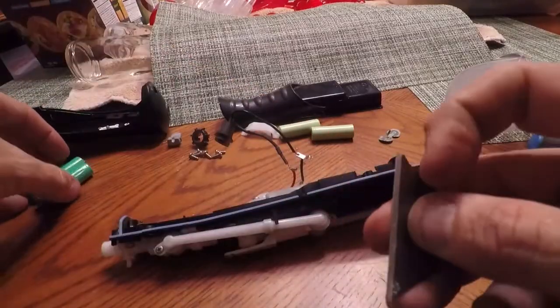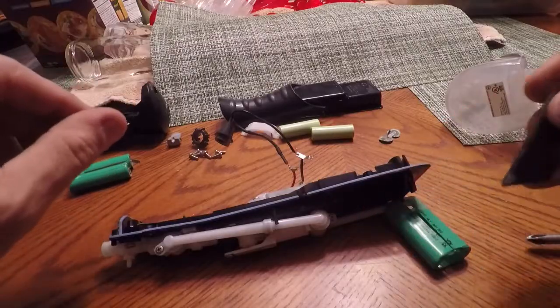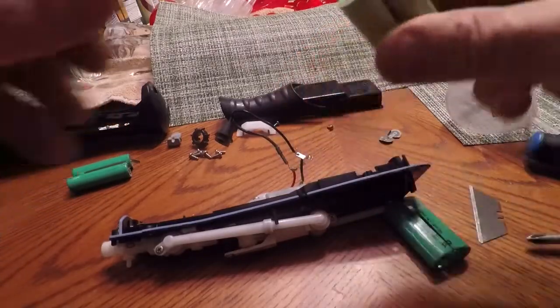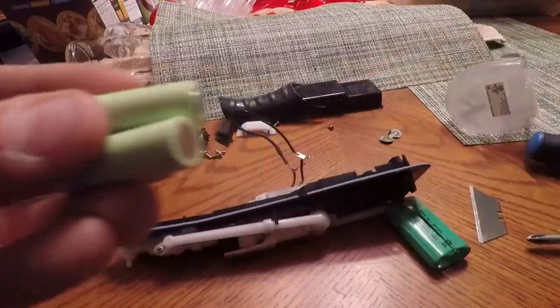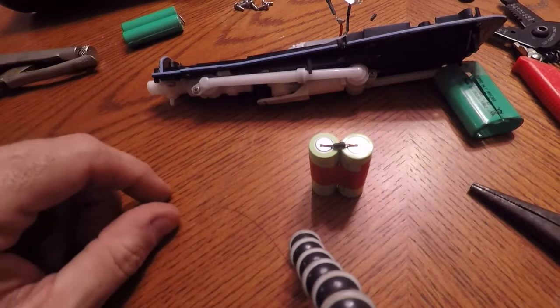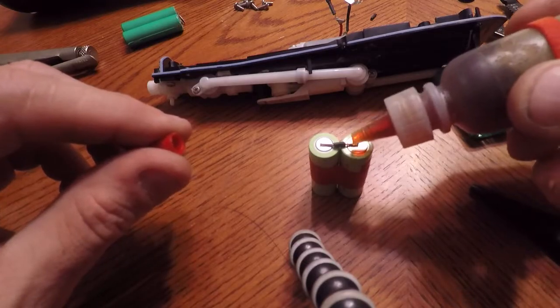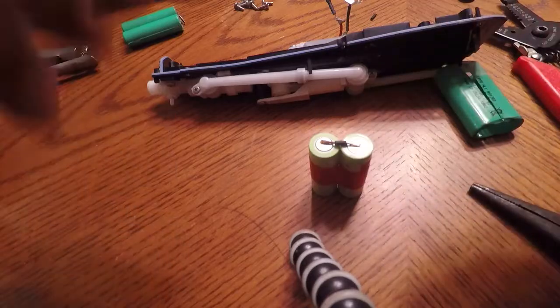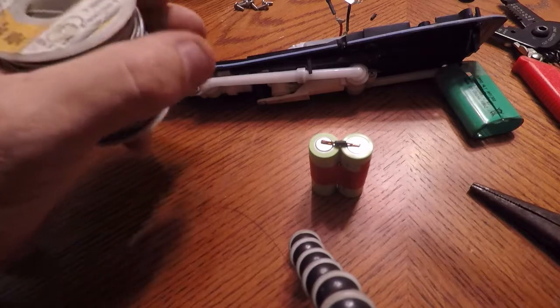Just two cells, and they are definitely positive to negative, positive to negative. I'm going to take these, wrap them with a little tape just to hold them together so we can work on them, and then go from there. I've made my little jumper wire out of a very small piece of wire. A little bit of flux on there. Waiting for the soldering iron to heat up.